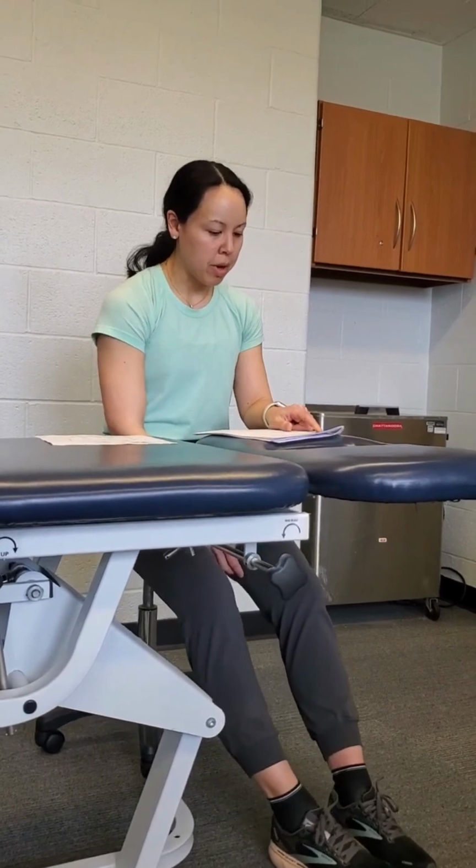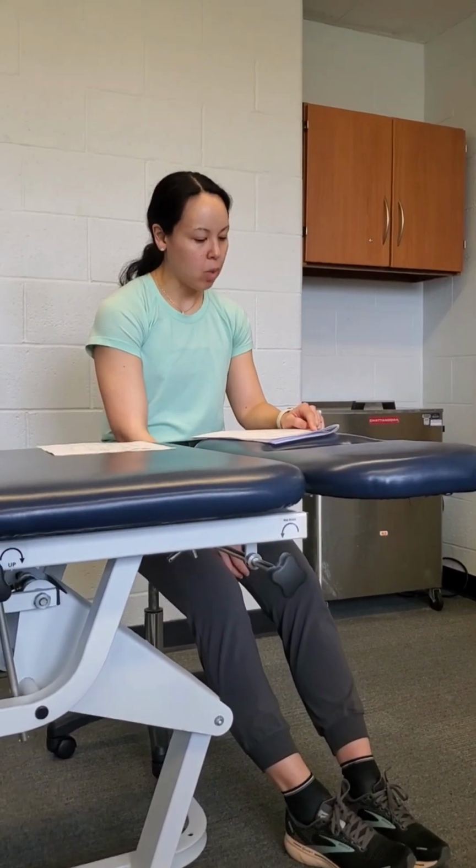so here it talks about the best practice. Pressure setting should be based on the limb occlusion pressure. Research studies have shown that occlusion can be achieved using a lower pressure when using a limb occlusion pressure method in conjunction with a wide tourniquet cuff in adult patients. So obviously the limb occlusion pressure is individualized, but that's why the cuffs are super wide, because you want that. What affects the pressure?